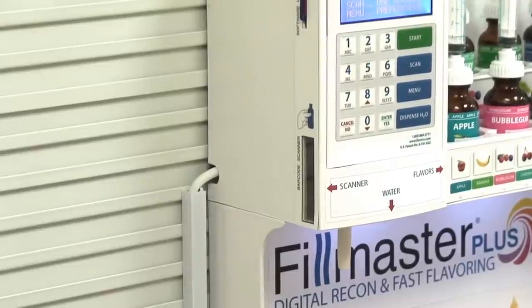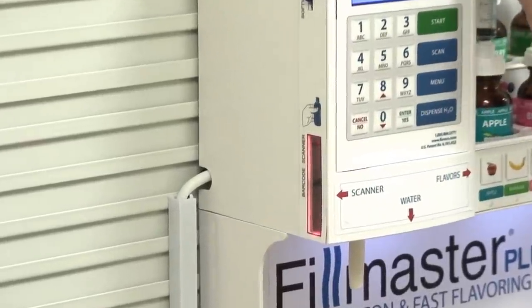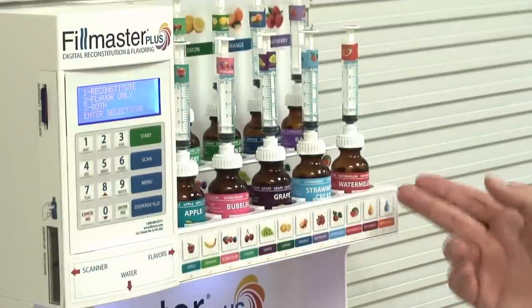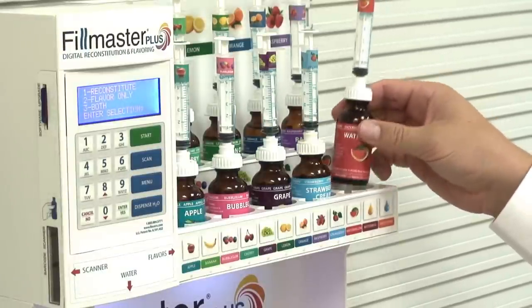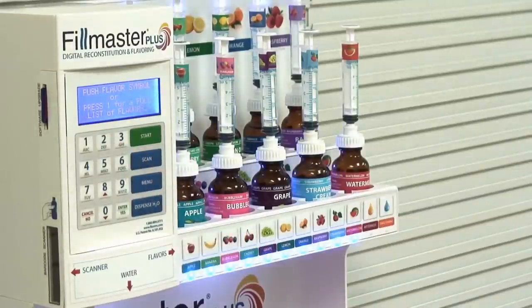The Filmaster Plus also features barcode scanning for accurate and quick reconstitution. For fast and easy flavoring, the Filmaster Plus has a compartment for FlavorX flavors. All flavors come with adapti caps and labeled syringes to speed up the process of flavoring. In addition, the flavor panel illuminates to guide your flavor selection.